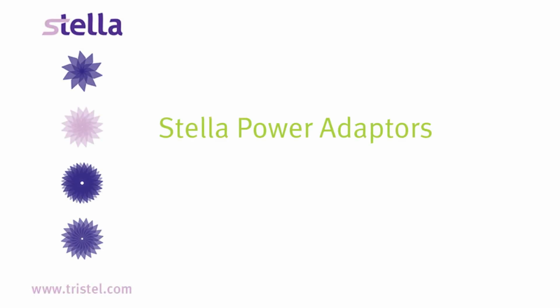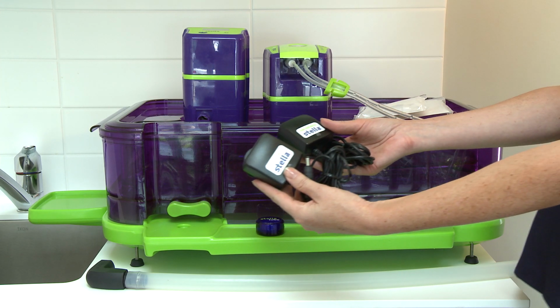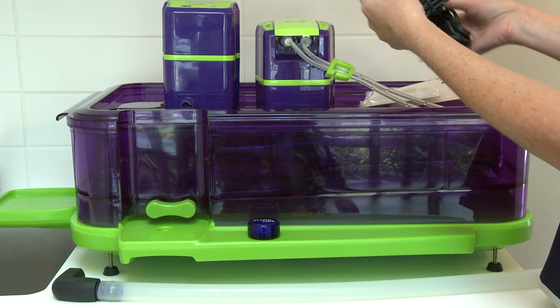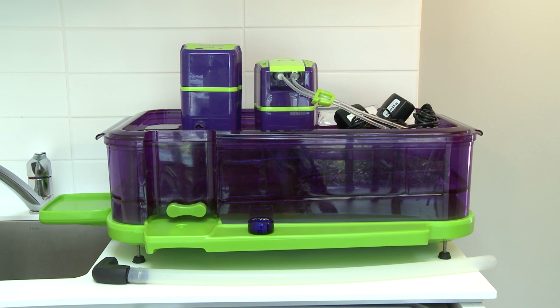Stella power adapters. 2 power adapters are supplied with Stella IQ and Stella Pulse. You can use either adapter on both units. Do not use other adapters to charge Stella components, and don't wrap cords too tightly when not in use.